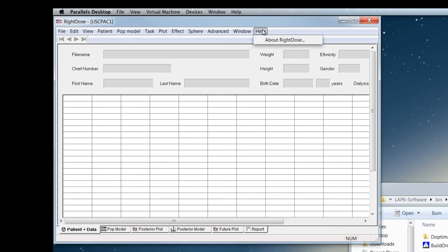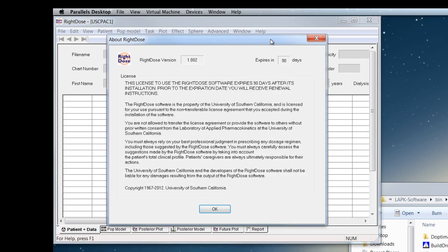Window and help are not used much. About right dose will give you the version and the expiration date, however, as well as a reprint of the license agreement.